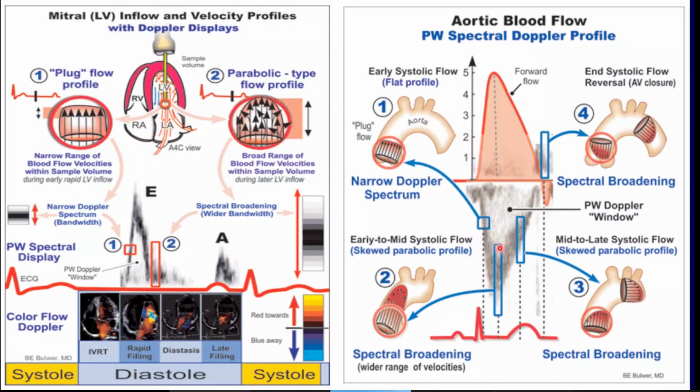On the right hand side, this was the mitral valve. We are looking at the aortic valve here, and here we are using the 5-chamber apical view in transthoracic echocardiography.